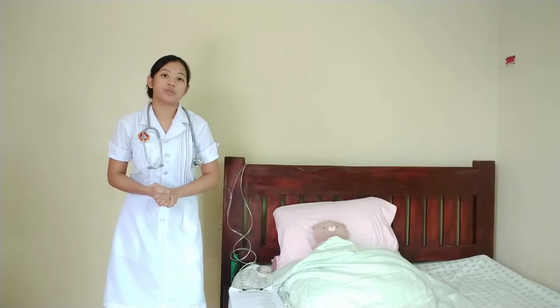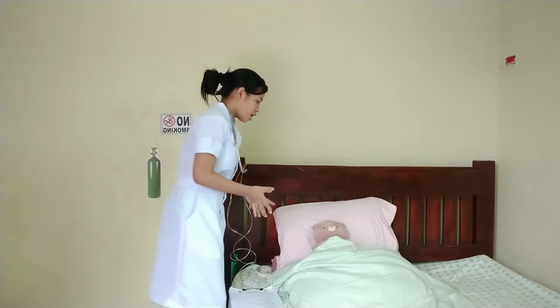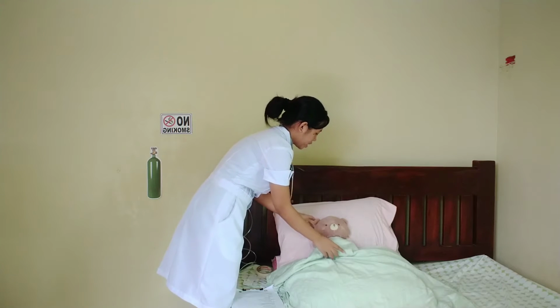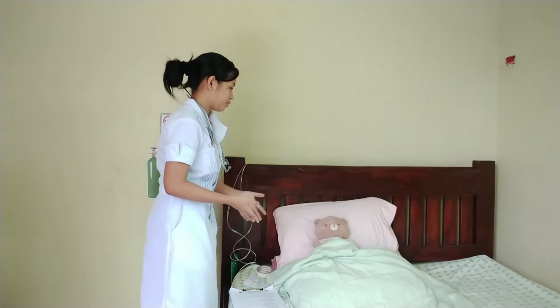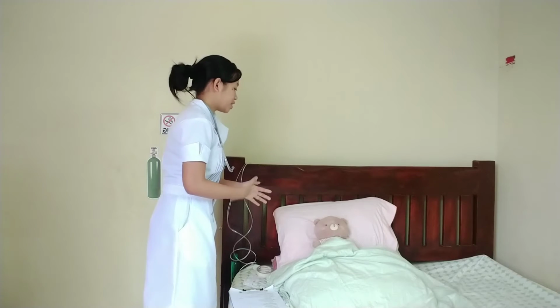And also I will be explaining to my client that the oxygen therapy is not dangerous as long as the safety precautions are observed. So, good day, ma'am. Let me just assist you to a semi-Fowler's position. Okay, ma'am. So, today, I will be giving you an oxygen therapy, and this is not dangerous as long as you will be observing proper safety measures.